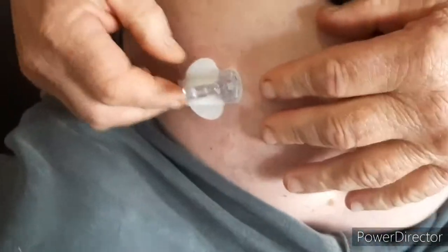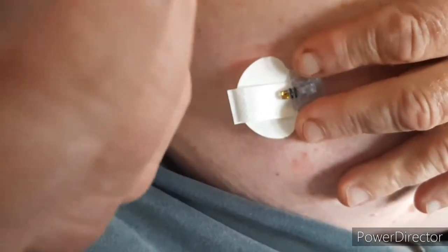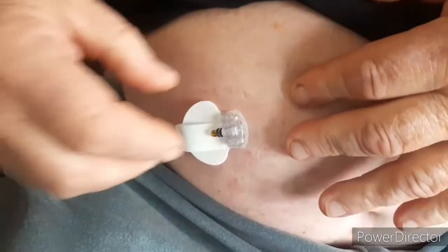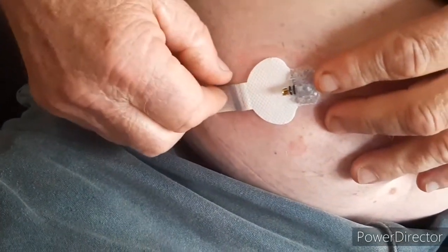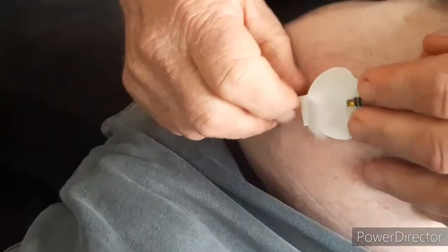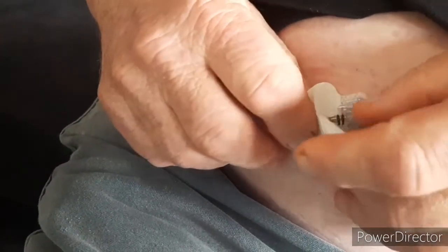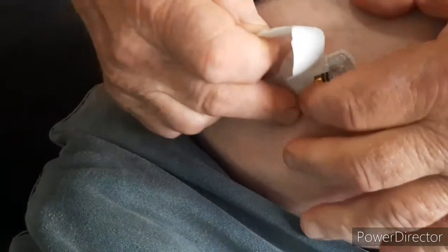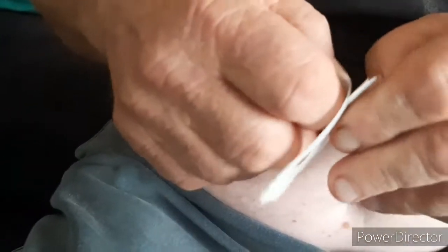Everything is out of there now — nothing left from the applicator. Hold each side of what remains and pull that out. Now grab the very bottom tab at the back and pull it out. As you do that, there will be an adhesive pad underneath — pull that out. Now get one of these adhesive pads and remove the backing.